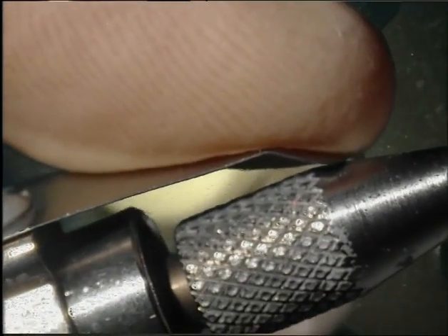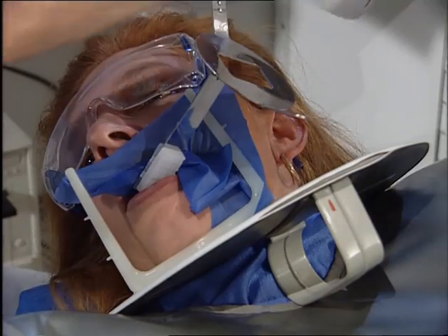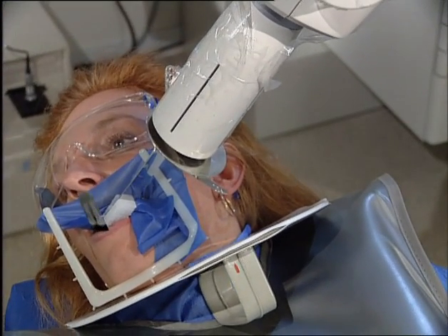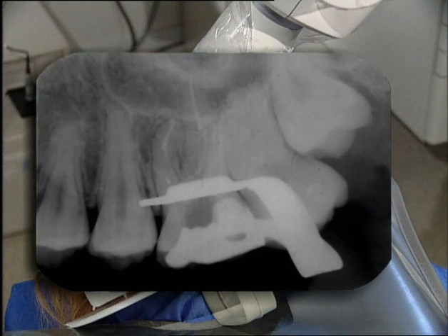Maintaining apical pressure, the plugger is activated again for a 1-second surge of heat to separate the plugger from the gutta-percha at the apical area. Coronal gutta-percha debris can be pulled out very easily using rotary NiTi instruments. A periapical working film taken at the conclusion of the downpack checks the three-dimensionality of the packing. At this stage, another wave of compaction can be done to improve the apical corkage.